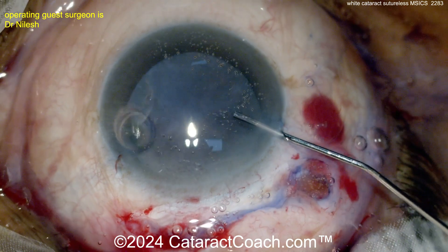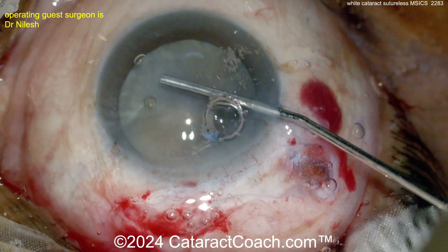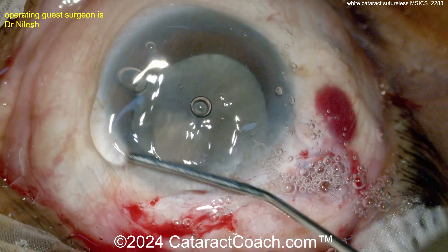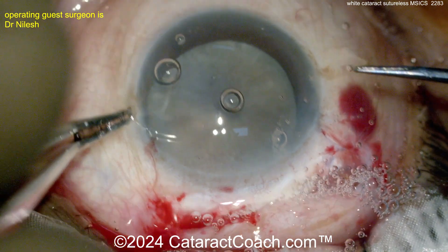Let that stain very nicely. Now here comes the viscoelastic — probably HPMC, hydroxypropyl methylcellulose. You can see how it spreads in the cornea very easily; that's HPMC in all likelihood.